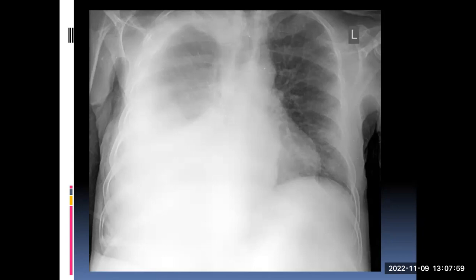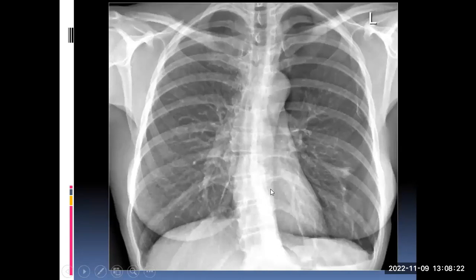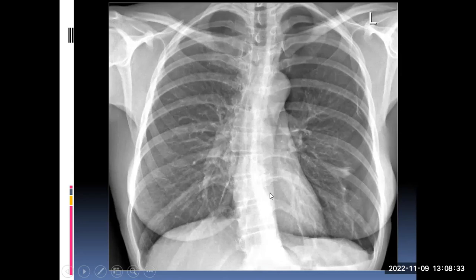But if the mediastinum is not pushed — if it is central — despite a large pleural effusion, then you have to understand something else is being compromised: there must be underlying collapse. When you see a large pleural effusion with an underlying collapsed lung, you have to suspect malignancy and proceed to cross-sectional imaging. Also, if a pleural effusion has a flat upper surface rather than a meniscus, something is causing pressure from above — that means there is air above the fluid, and you can safely assume this is a hydropneumothorax. A hydropneumothorax will always have a flat upper surface.